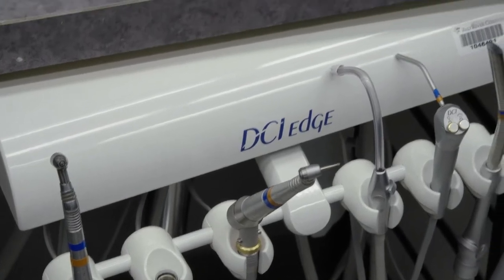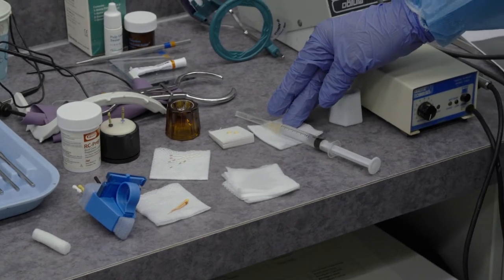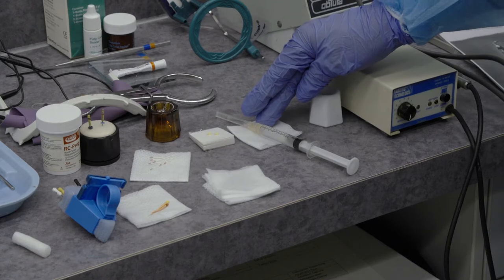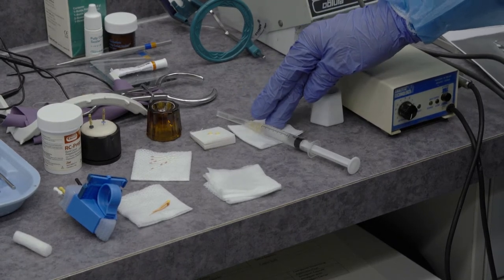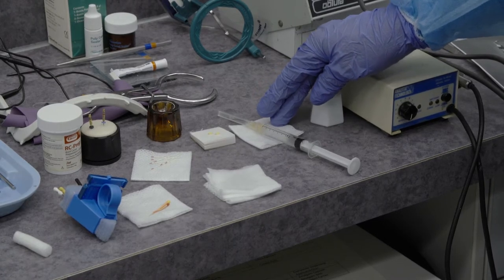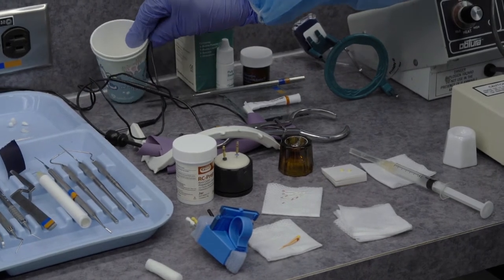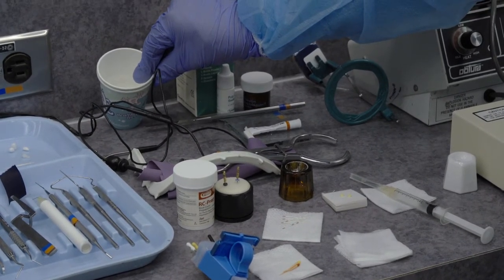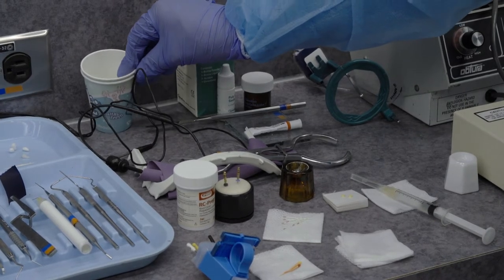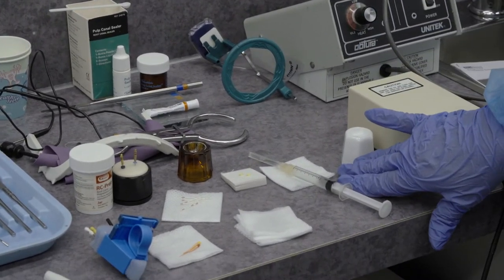We have ready to go the irrigation syringe, which is filled with sodium hypochlorite. And sodium hypochlorite is a mixture of water and Javex. The Javex ratio is 5% to 95% water. And in a cup, you're going to have. And of course, here for the procedure, here in our setup, because it is a simulation, we're utilizing just water. But in a dental office, it would be the sodium hypochlorite that is in the irrigating syringe.